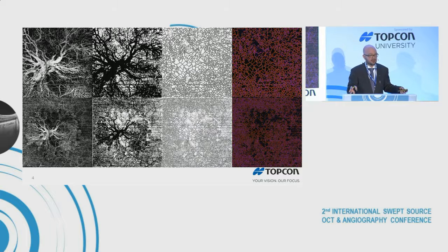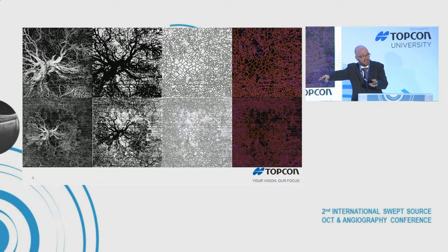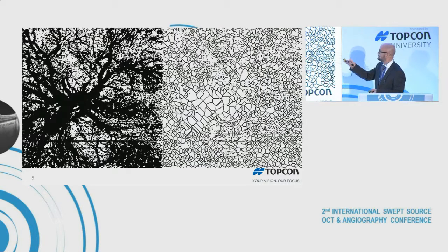So far, so clear. This makes relatively good sense. The problem is that these types of lesions are not two-dimensional. They are three-dimensional. So if we're looking at this kind of lesion, and if we're looking at this kind of visualization, we've actually flattened a slab, and then we're analyzing that slab as if it should be just a flat plane. But it's not. It's a three-dimensional lesion. So all of these kind of structures are actually not completely correct.